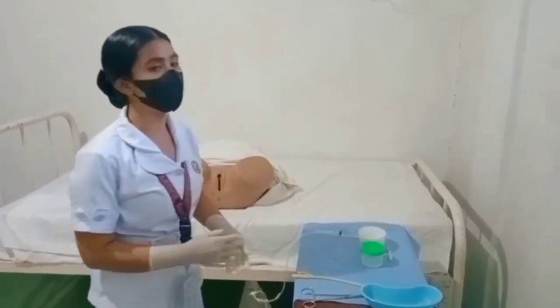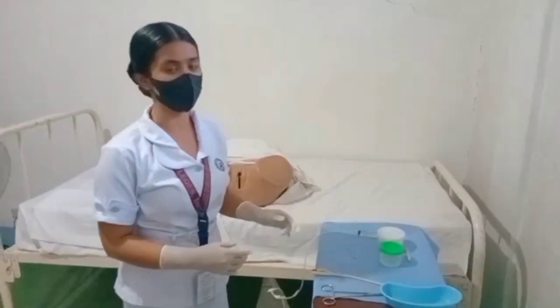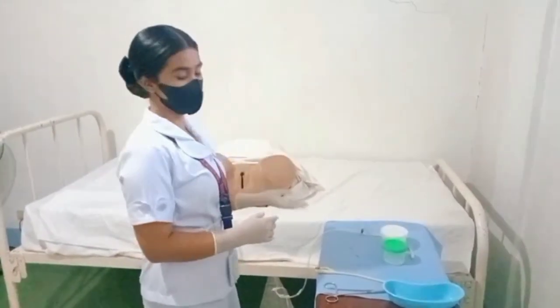And next, I am going to connect the distal end of the catheter to the drainage tubing.